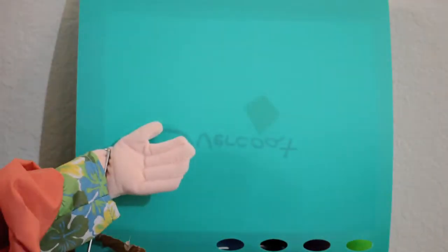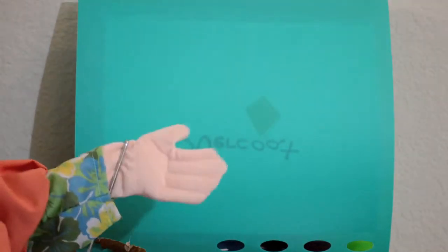This is Dr. Isla, and I'm here to talk about X-rays and the films and screens used to make an image. This is an X-ray film. A permanent image is recorded on it after being exposed to photons, which we'll explain later.